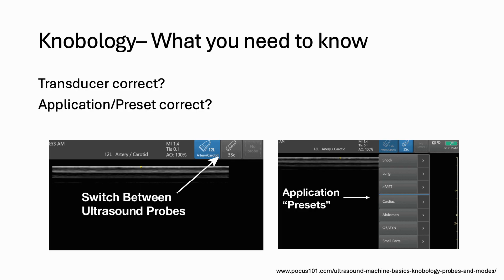And so if you're looking at a fetus, when you're trying to measure, the sono will self-correct and adjust, which is amazing, because as the sono machines have better technology and more innovation, it helps you, and so it will adjust and have the right gain and the right depth for what you're supposed to be looking at. So you will make sure that the right application, or another word for it, a preset, is correct.